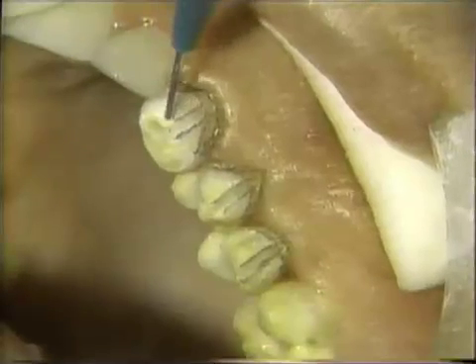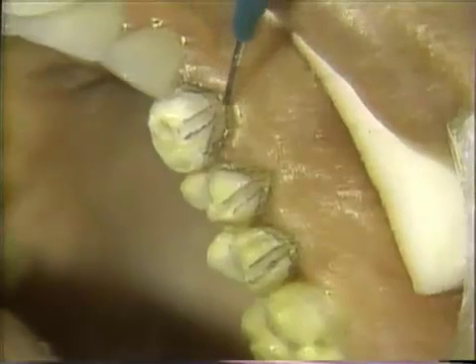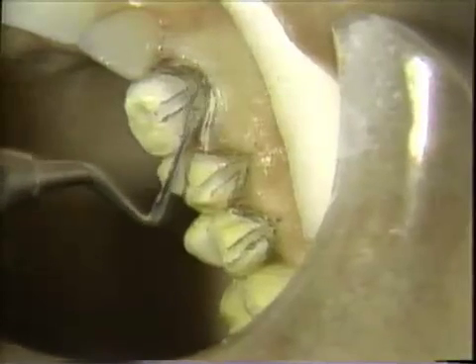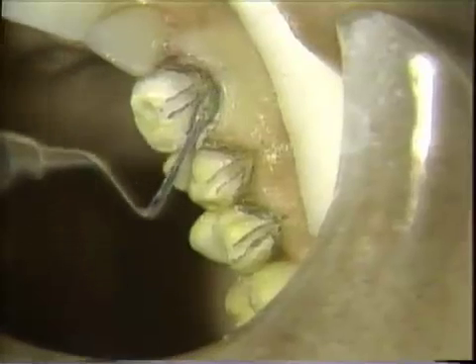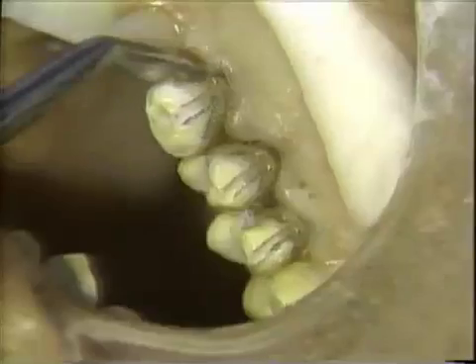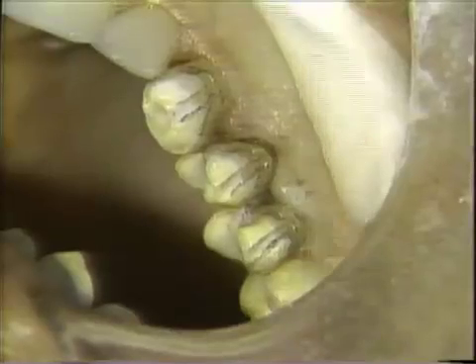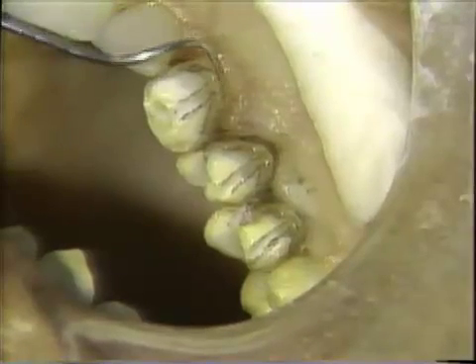The preparation thus far has been outlined with pencil. The preparation is tissue-packed to allow us to bring the finishing line under the soft tissue. The tissue pack is removed and you'll notice that we have much more of the tooth exposed to develop our cervical finishing line.